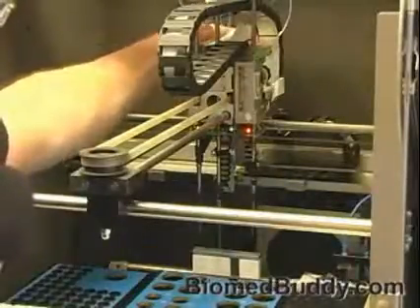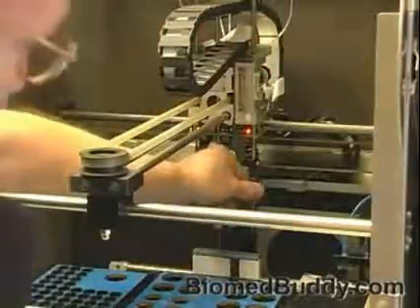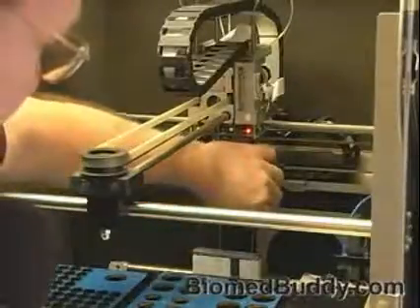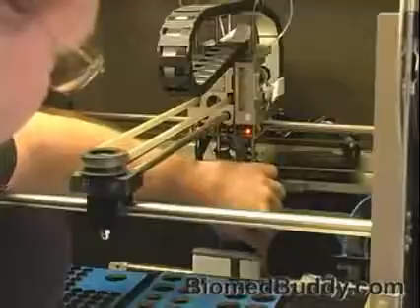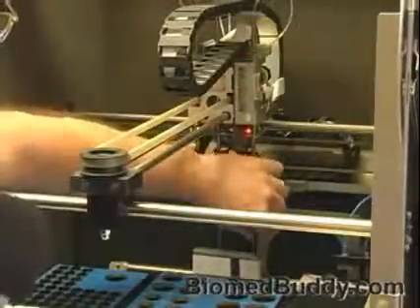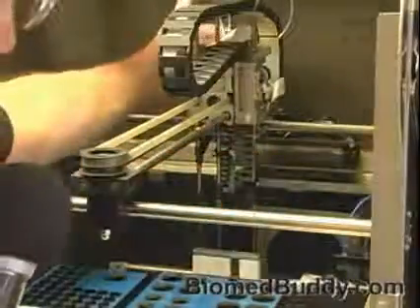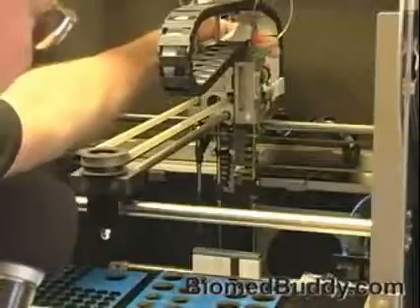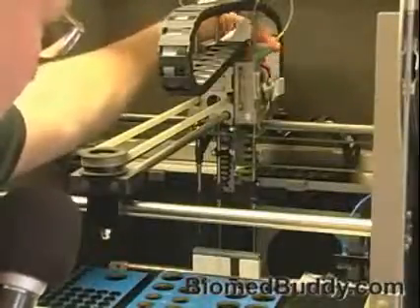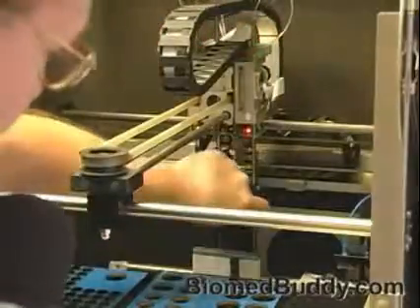And now to arm number 3. Alright, let's put it down by hand. See how that's off quite a bit. And that's because it was bent. And we're not going to try to replace that needle. This is what I mean by saving yourself the needles, because there's nothing wrong with this needle. You can go back and check it out later, but the odds are that there's nothing wrong with that needle. But it is a little bent now. And like I said, if you saw me doing the endurance, you know why it was bent. Okay, for the most part, that goes down right into the center.